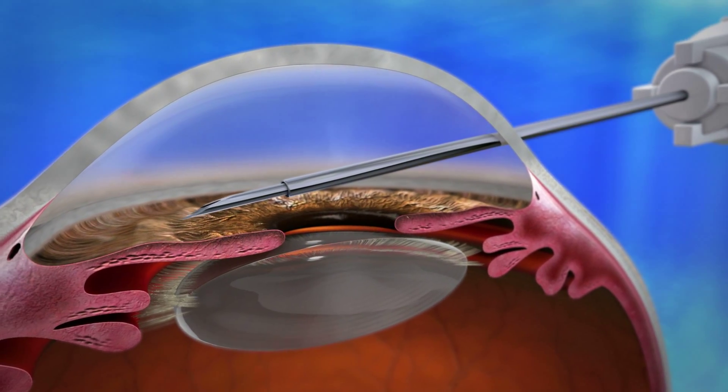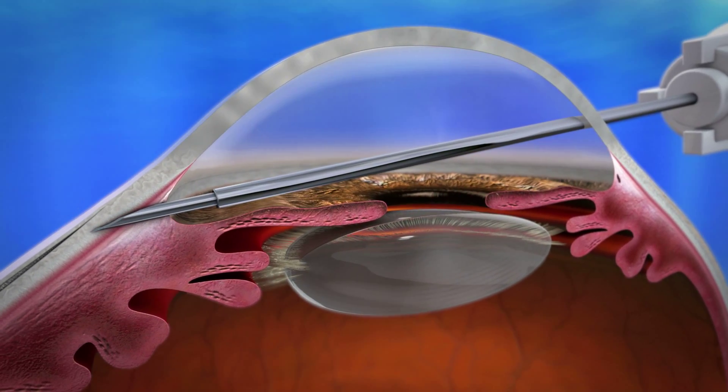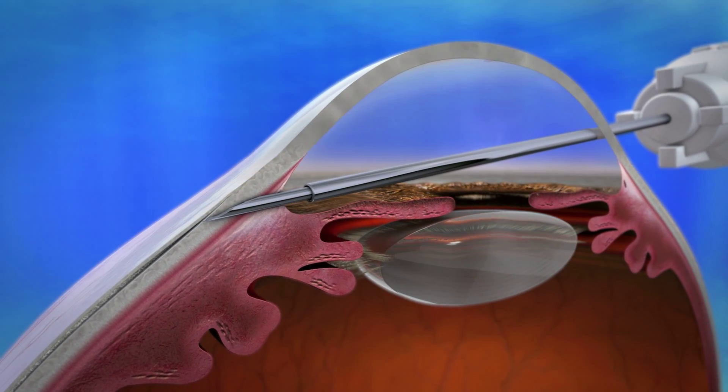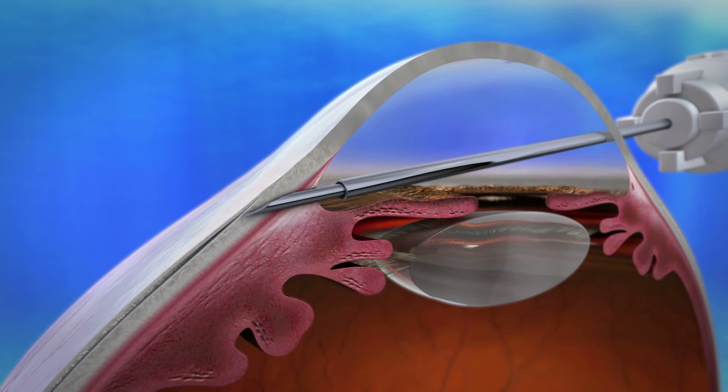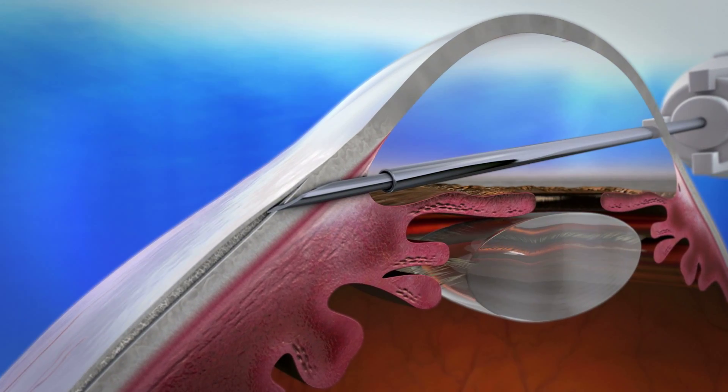The needle is inserted through the trabecular meshwork, creating a scleral tunnel to the subconjunctival space. Once the needle exits the sclera, the location is verified, or adjusted as needed. The injector is further advanced until the full bevel of the needle is visible.